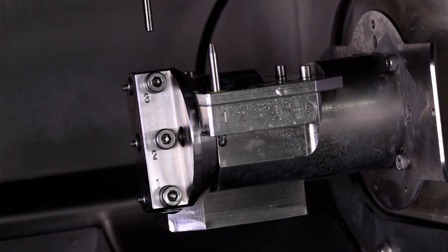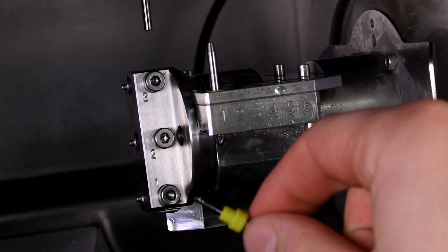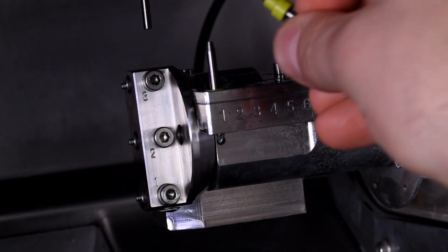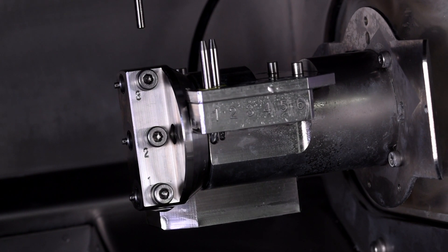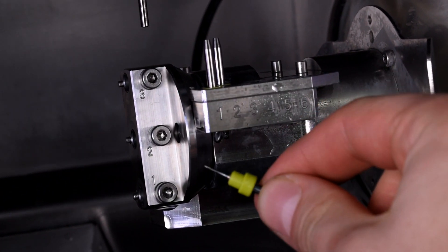To produce custom abutments from pre-milled titanium blanks, your DWX42W needs to be fitted with specialist 3mm, 2mm, and 1mm diameter ball end milling burrs.